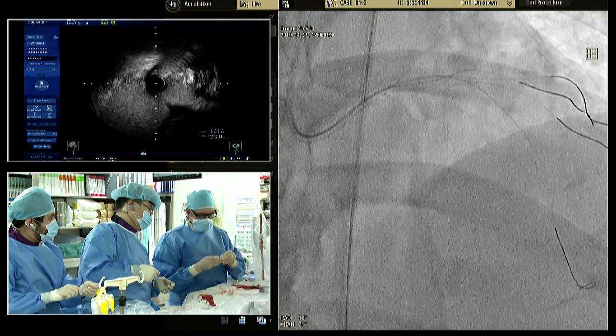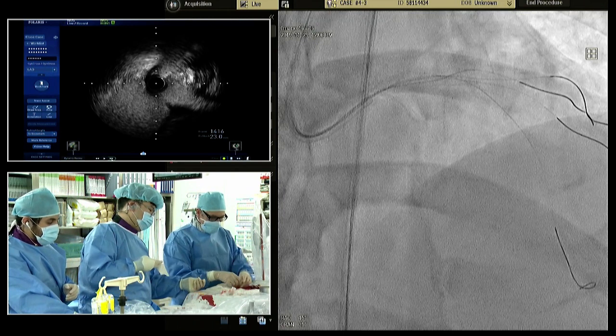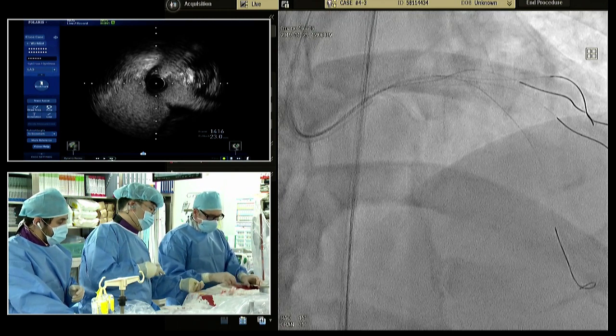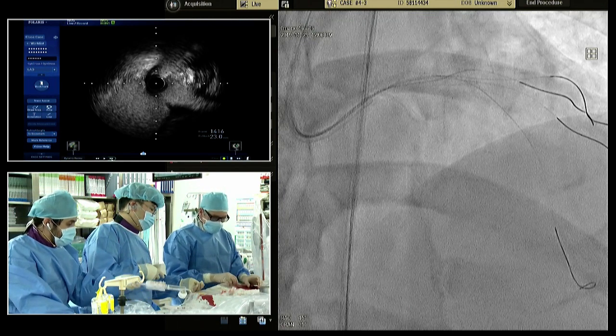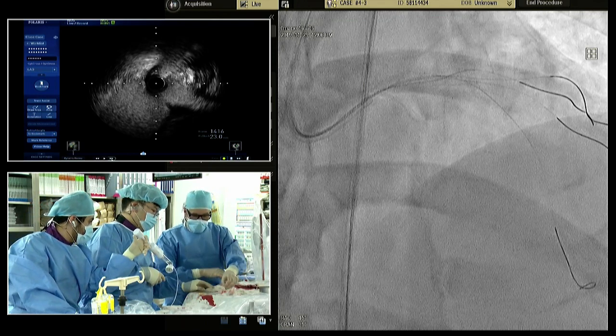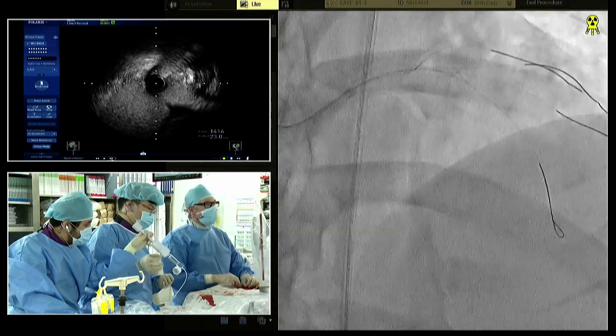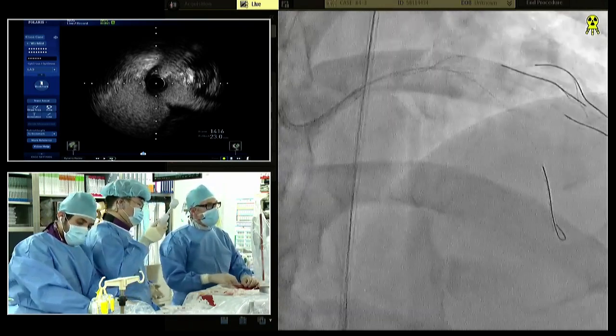So do you have a 2.75 for the other branch? Yes, okay. What's the panel's opinion? The side branch really is the ostium or the carina shift. So was the choice of kissing instead of ordinary balloon using a DEB? We actually tend to, now, use more DEB for the ostial side branch.